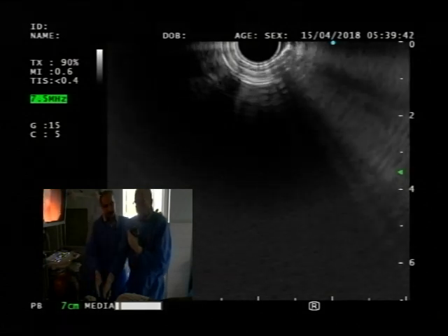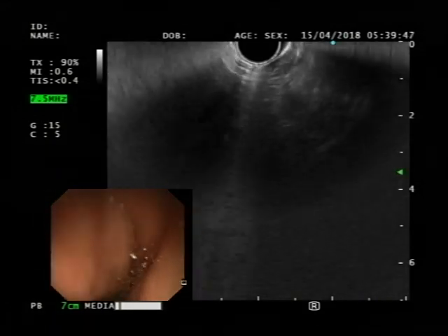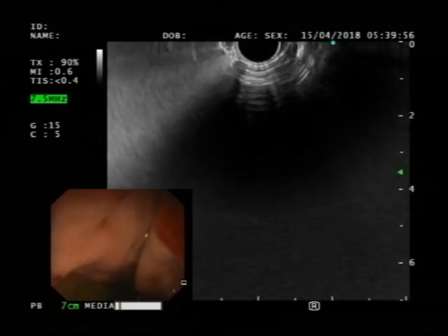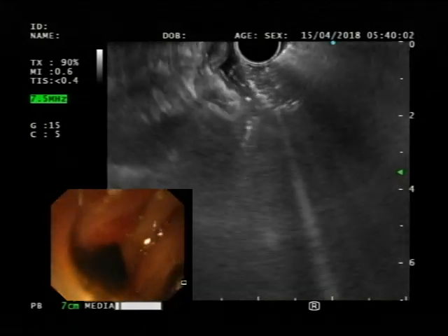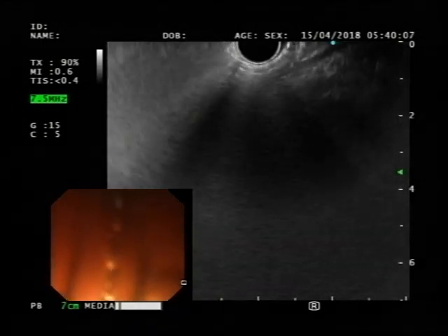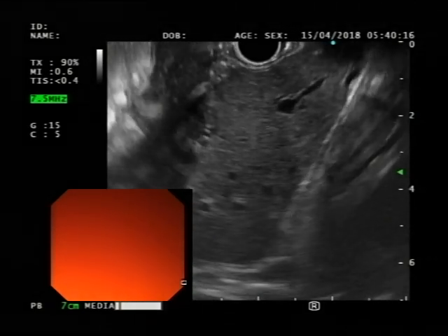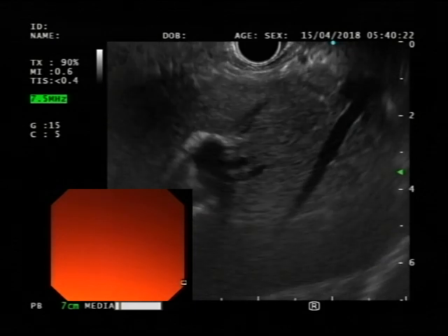Okay, now here you do have to face the patient more. So there, this, and then there, and now you can spin over to the right. There you go. You have your liver coming towards you. Good. And now left hand up. There you go. There's your liver. Excellent. Now spin it all the way till you lose sight of it. Now go clockwise all the way the other way. Keep going, keep going, because you're evaluating the liver as much as possible.